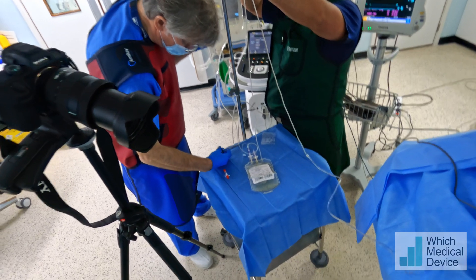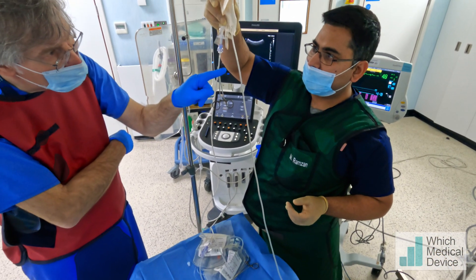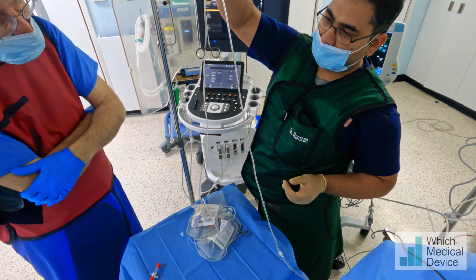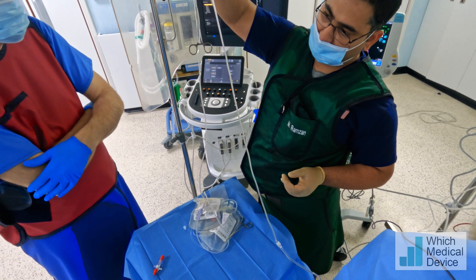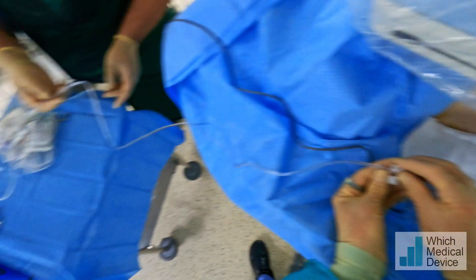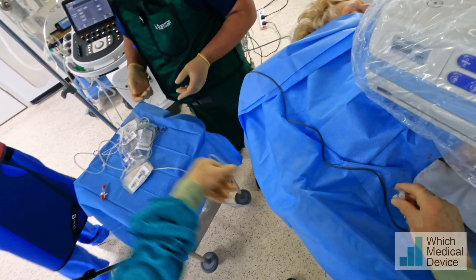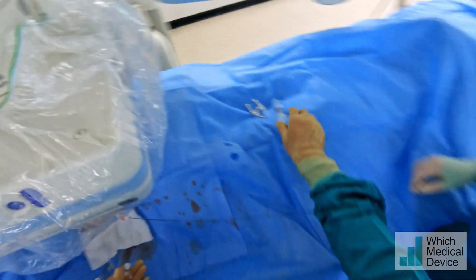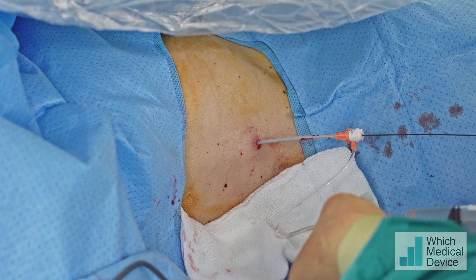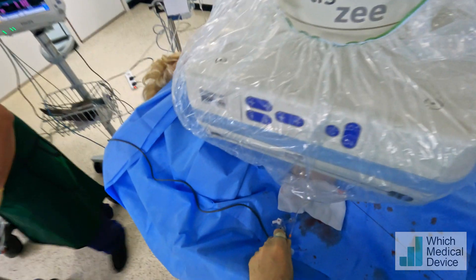That's all the wash-through. The last bit coming through is the air at the top, so we'll follow it all the way down, and when it gets to the end of the tubing we'll turn the sheath valve off. After that we'll flush and check the portal pressures again. There it comes — that's through. We'll give it a flush to get the very last bit in and check our position hasn't changed and the sheath is in exactly the same position. We'll now recheck the portal venous pressures.